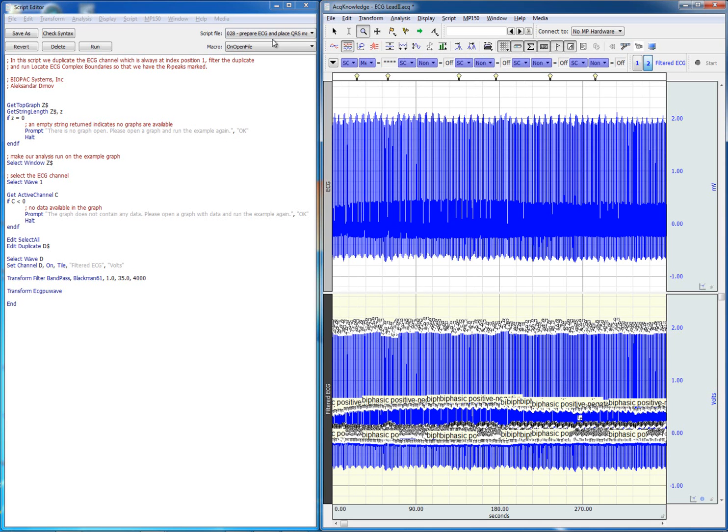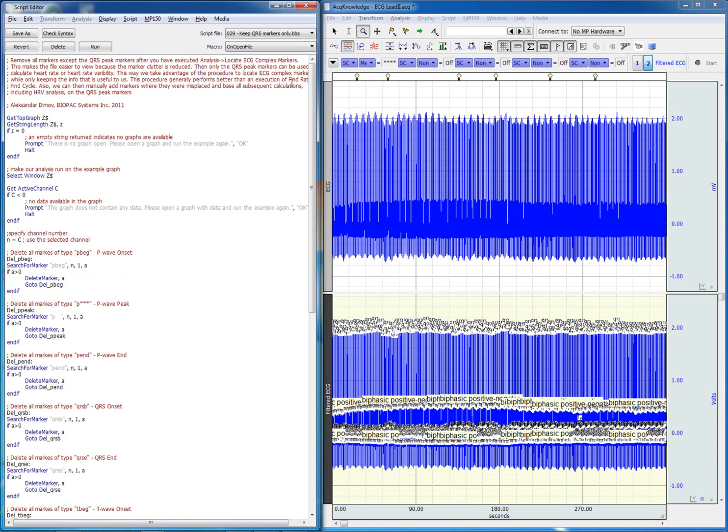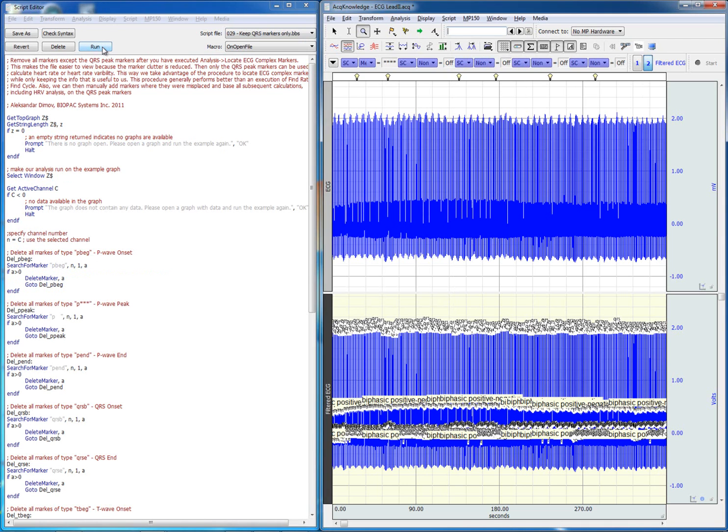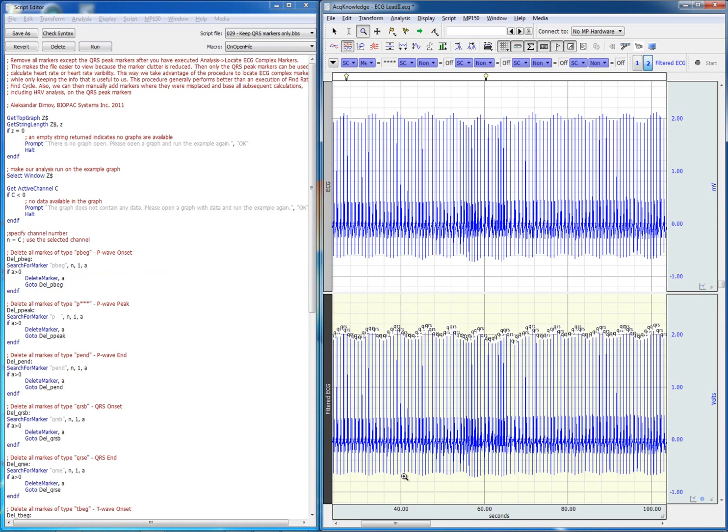We can go ahead and delete those markers by using a different script. Now we have eliminated everything except for the QRS markers.